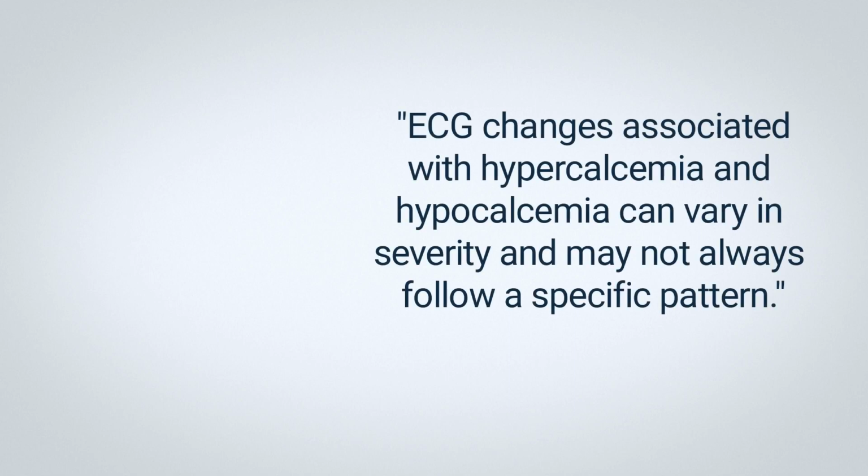It's important to note that ECG changes associated with hypercalcemia and hypocalcemia can vary in severity and may not always follow a specific pattern. Additionally, other factors and comorbidities can influence ECG findings. Therefore, clinical correlation and interpretation by a healthcare professional are essential for an accurate diagnosis.